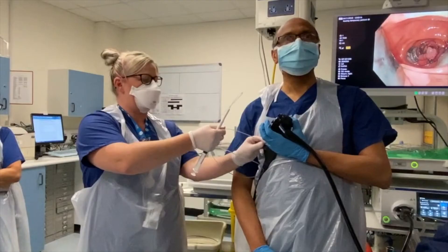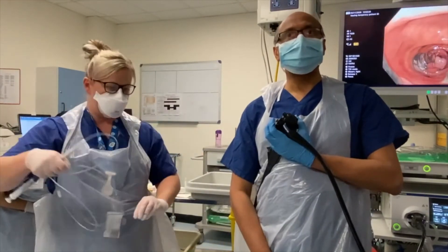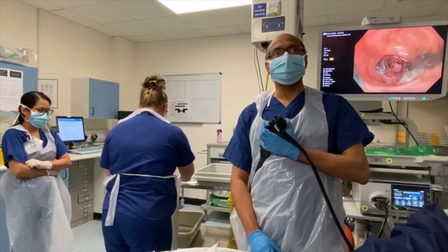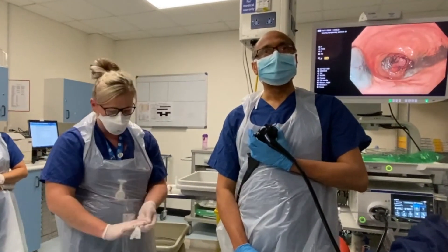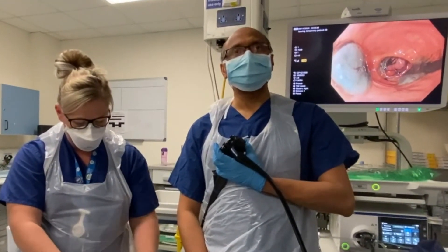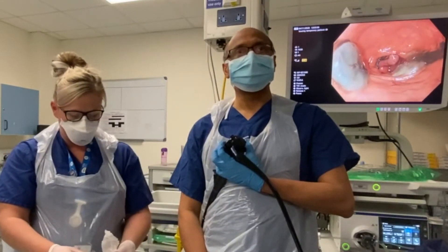So we got two tattoos diagonally opposite to each other. They're a little bit bigger than what I would normally want, but if the patient is going for a radical resection then it doesn't really matter. A submucosal lift followed by tattoo on the anal side, and we'll put this in the report so there will be no confusion.